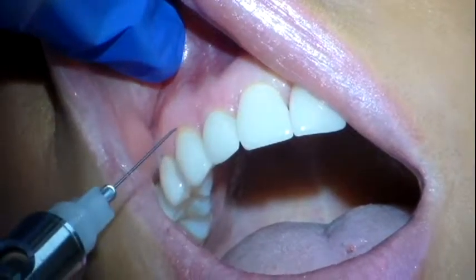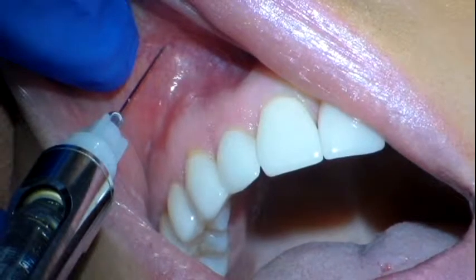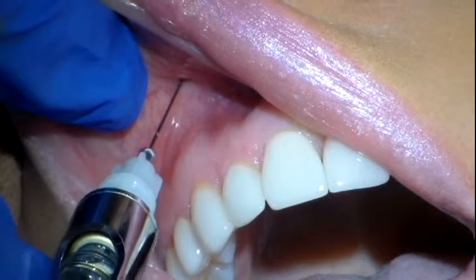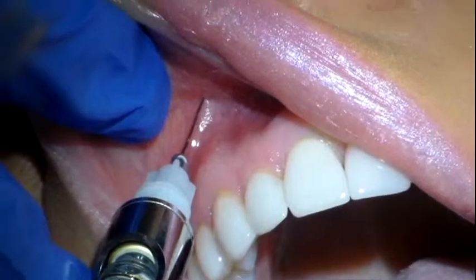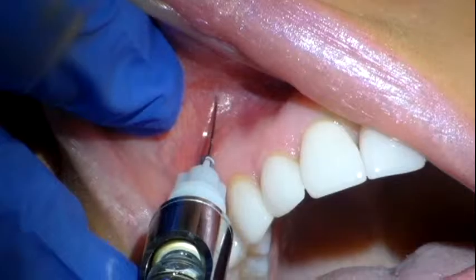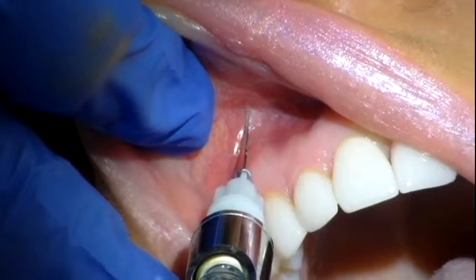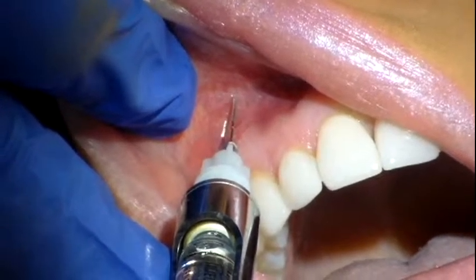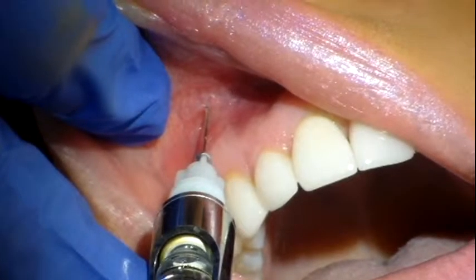I caught the barrel. I'm going to go in and I'm going to match the slope. I'm out about 3-4 millimeters from the bone, and I'm going to penetrate. Just cover the bevel. I'm going to aspirate. It's negative. I'm going to deposit some comfort drops, and I'm going to wait 5 seconds. And then I'm going to proceed in. And now I'm at site. I felt contact. I felt resistance, so I backed off about 1 millimeter.